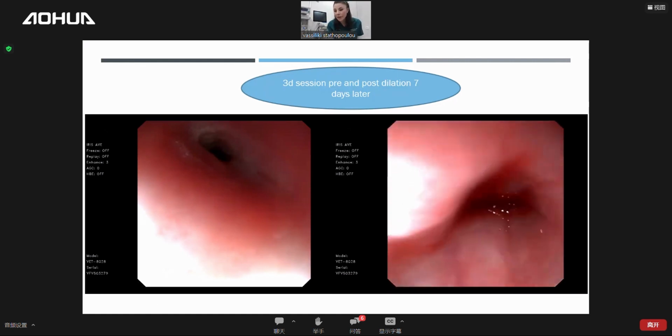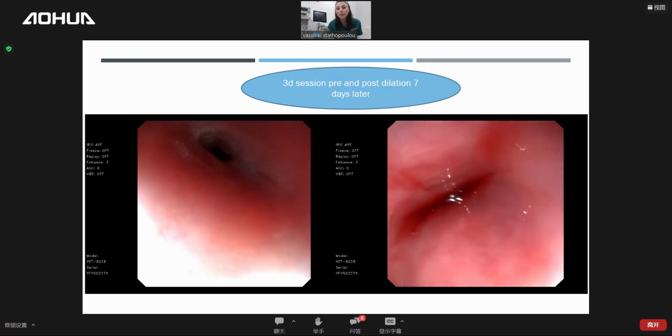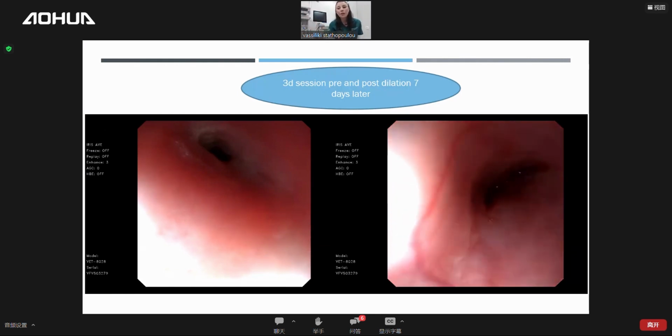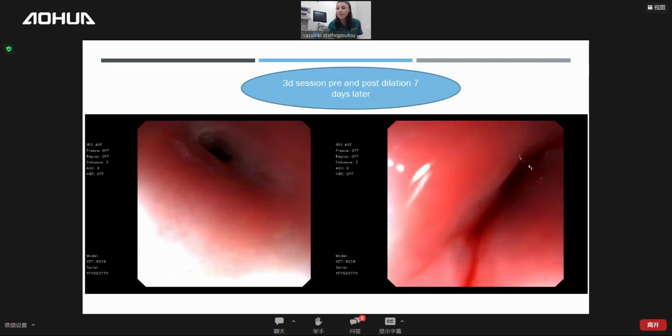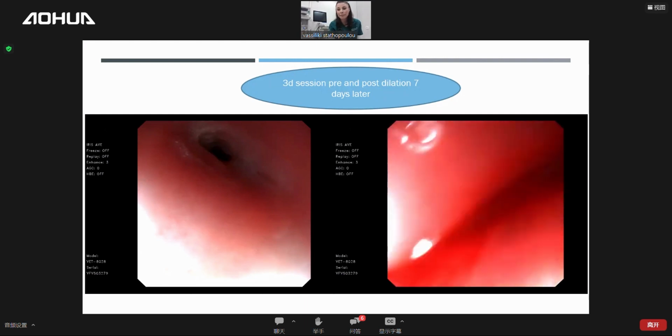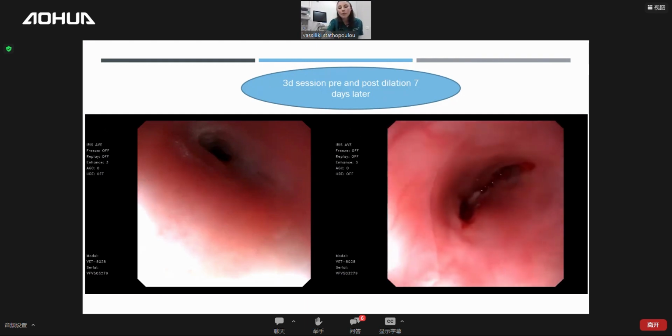It needs patience and it needs the owners to actually pay for these procedures. These can take up to 14 sessions. And this is not something cheap. These are expensive procedures. So now we have ruptured again.